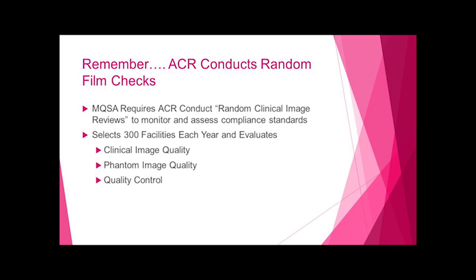So remember that ACR conducts random film checks. MQSA requires these random clinical image reviews to monitor and assess compliance. They select 300 facilities each year, and they evaluate the image quality, the phantom image quality, and the quality control. So your facility could indeed be selected for one of these.